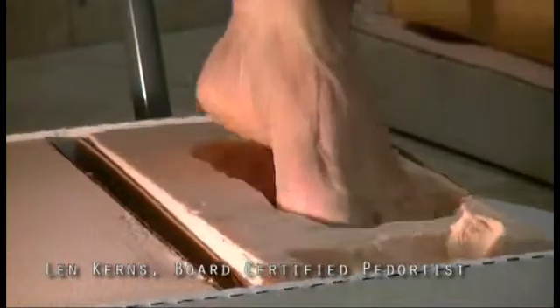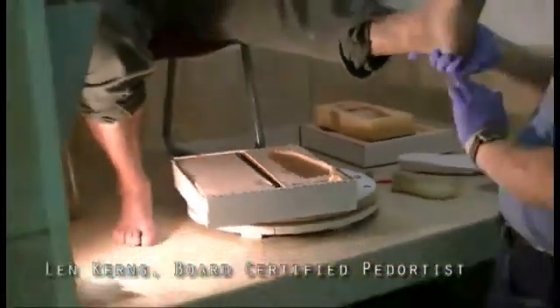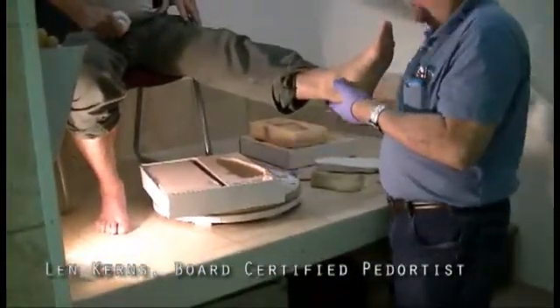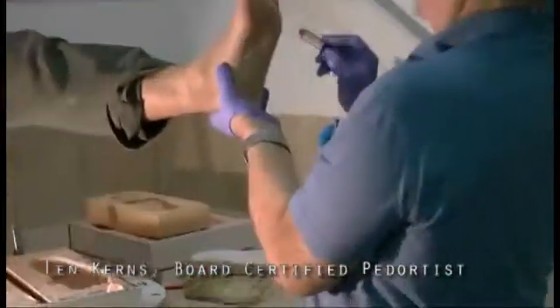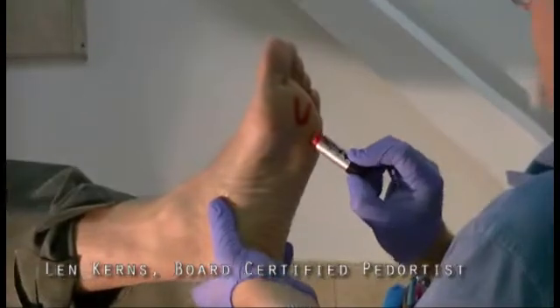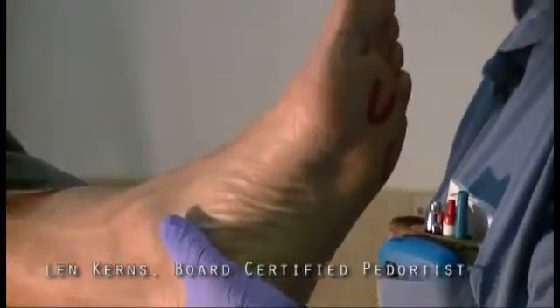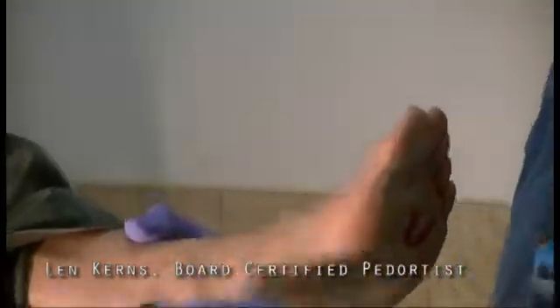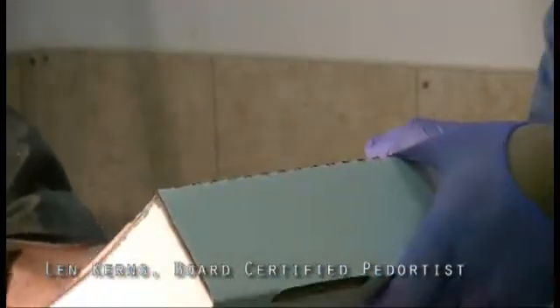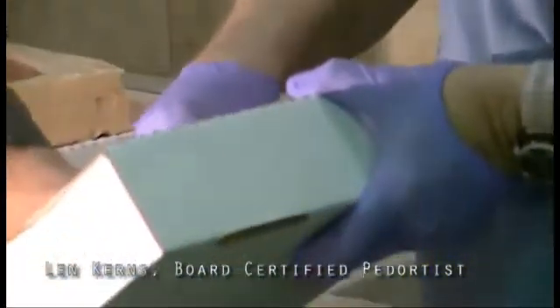Now I lift this up. Now, if you had a foot with calluses, and there was a callus here, and it should be marked on the form, you take the lipstick and you could draw, let's say, a U right here, and you could show me this fifth has a callus here, and you can do this either before you cast the foot, which we'll do on the next one. You can lift the box up, put the patient's foot in, and just push a little bit.